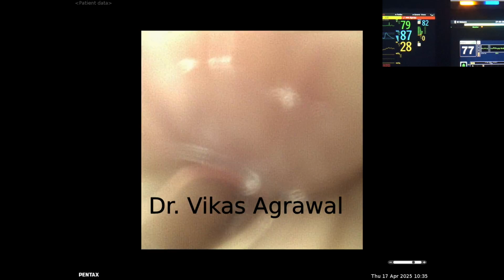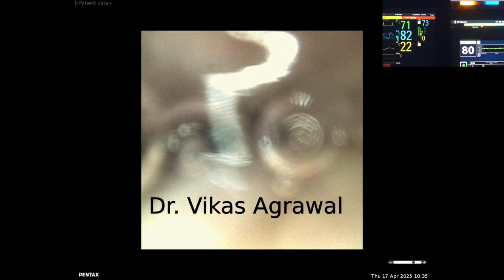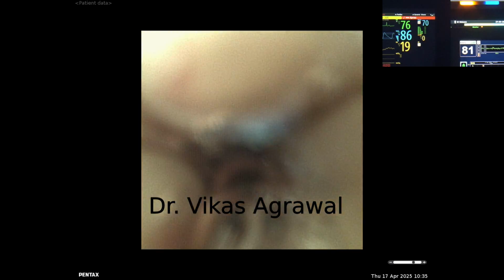His palate is collapsing. Now the BIS is in the correct range, 70s, and we can see a complete collapse of the lower part of the soft palate, which is both anteroposterior and lateral, but majority anteroposterior. You can see both AP as well as lateral.